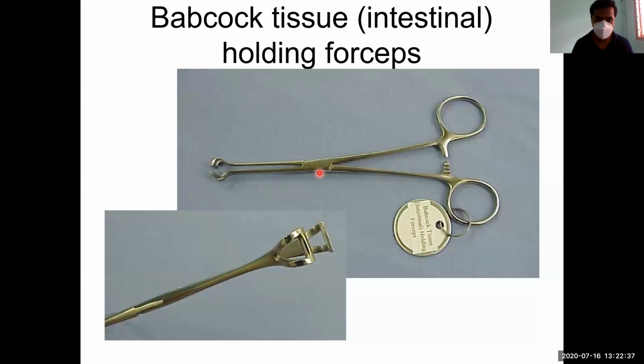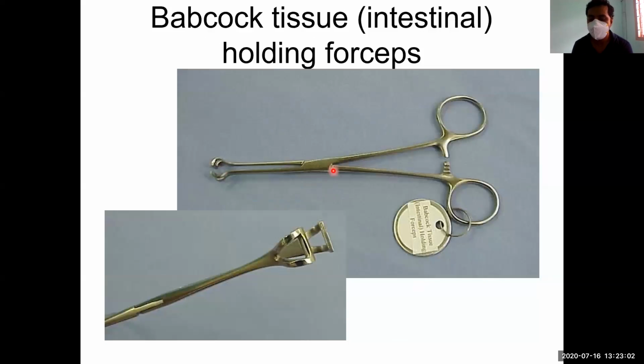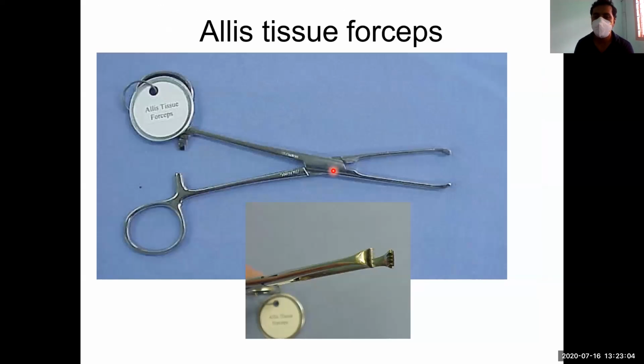So, see, when we hold the appendix with this, the appendix will be in this gap, so that it doesn't get crushed. This can also be used. Even Allis forceps can be used during various other operations like gastrojejunostomy, meaning any kind of anastomosis, to hold our anastomotic parts before anastomosis.